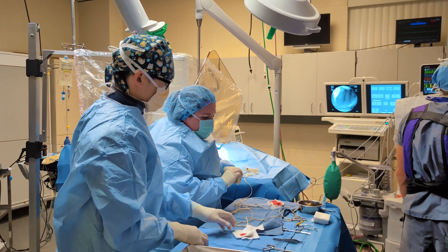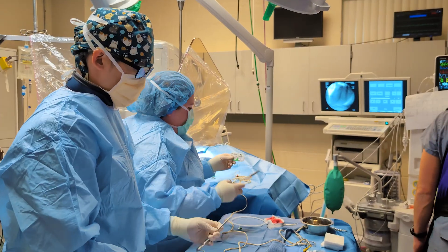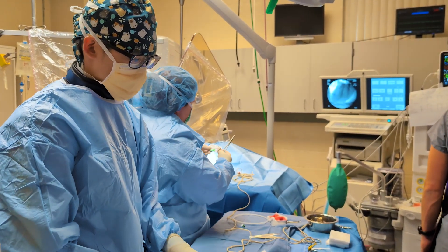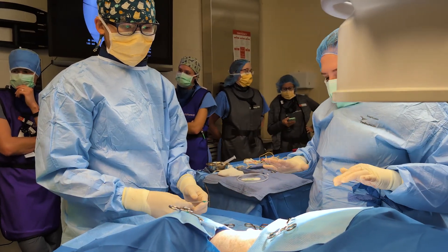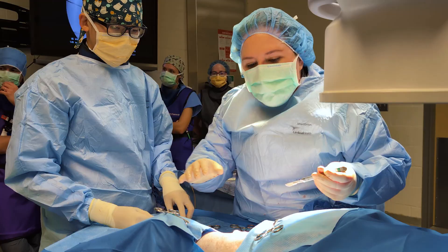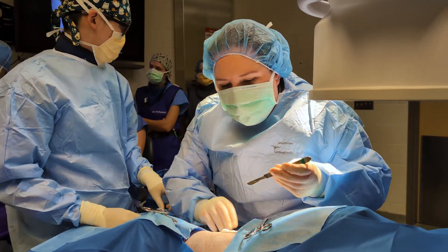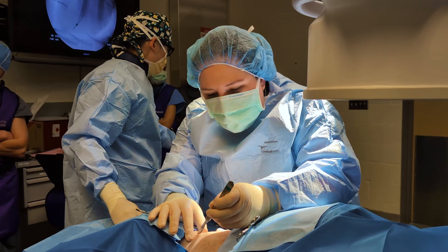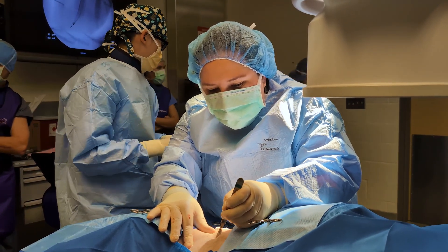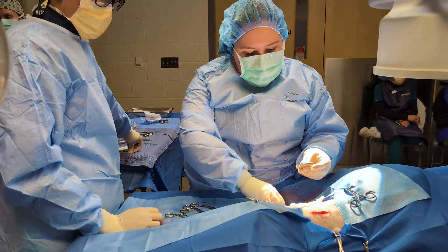After we are satisfied with the placement, we then tie the lead to the jugular vein and ligate the jugular vein in multiple spots. We then track the lead up to a separate incision, kind of higher up in the neck, where we will place the generator, or the battery pack for the pacemaker. The generators themselves are relatively small — slightly bigger than a silver dollar.